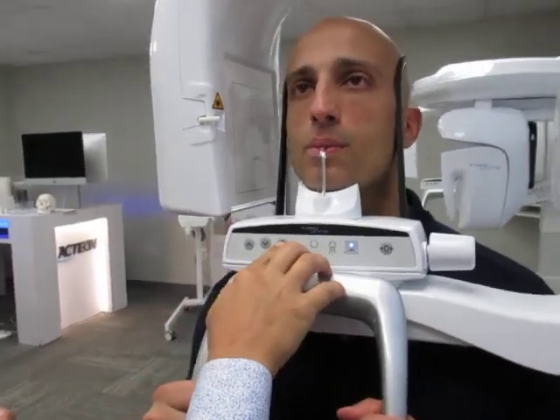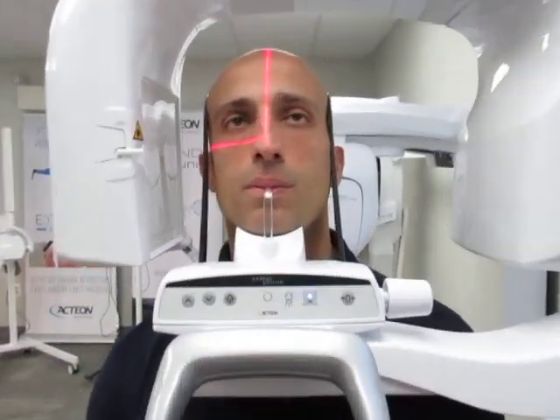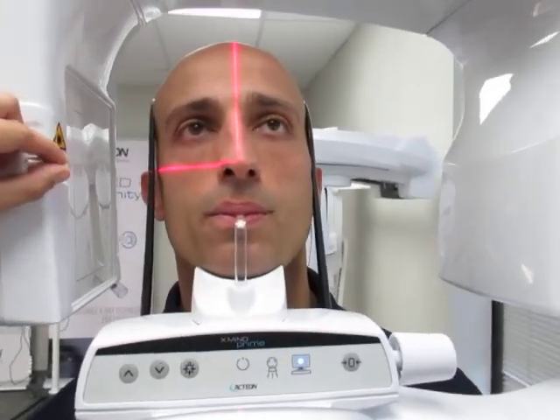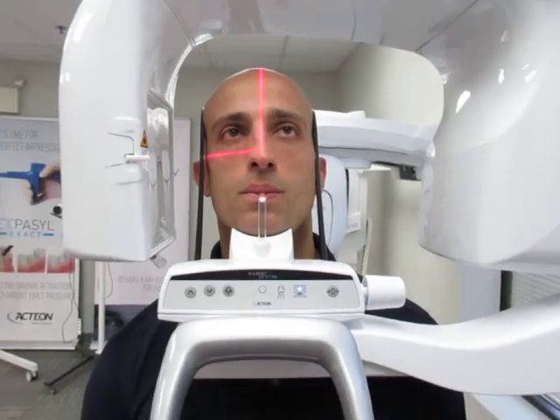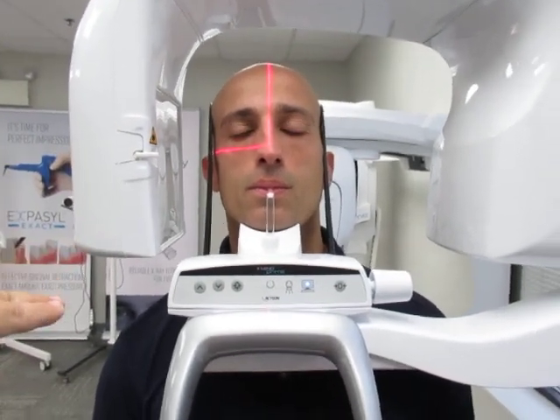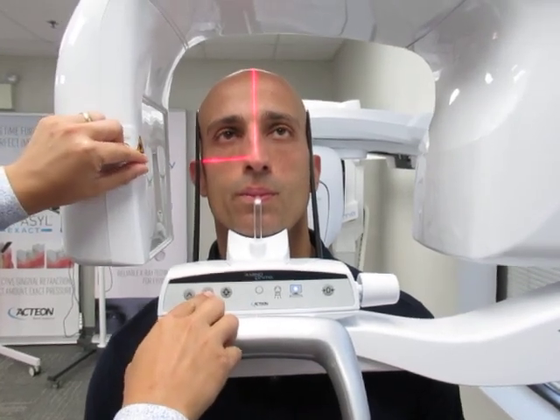When I turn on this laser, this is going to make sure that the mid-sagittal line is right down the center of the nose. And then we are going to use the Frankfurt laser over here to make sure he's on plane. Every panoramic image needs to be about 5 to 10 degrees angled downwards with his chin. So we're going to use this just for your own reference point.